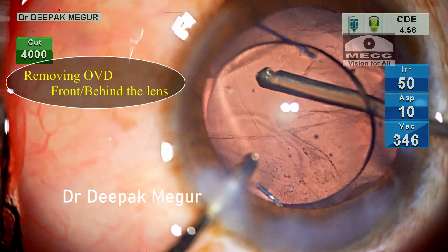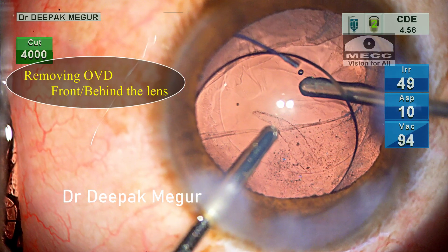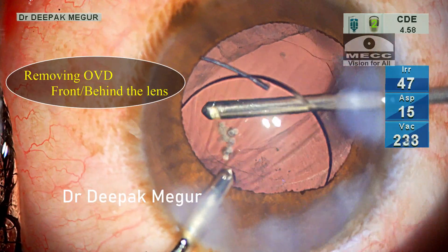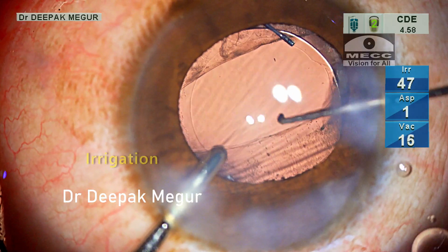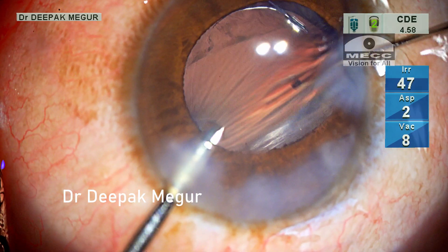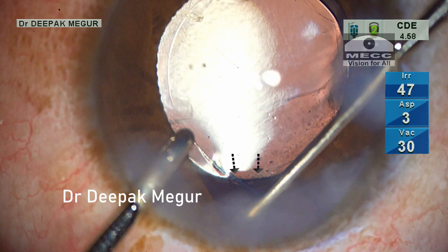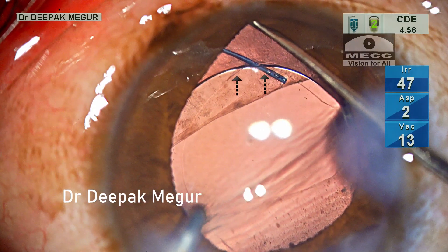I go in with my vitrector posterior to the lens into the vitreous cavity to remove all the OVD which has seeped in during these maneuvers. It takes a couple of minutes to clean up all the OVD behind the lens, and I am careful to aspirate all the viscoelastic sticking to the posterior surface of the lens. Once we have a clean lens, it's time to achieve optic capture. The right hand uses the lens dialer to nudge the optic backwards until we see ovalization of the rhexis — the ovalization is confirmatory that optic capture is successful.